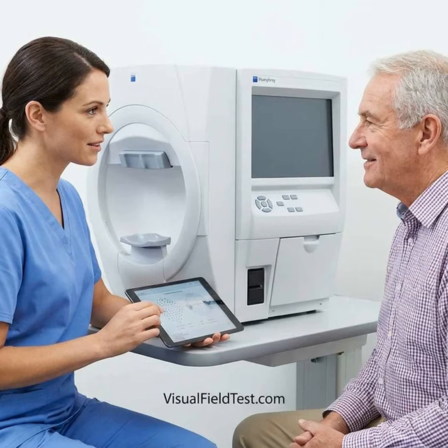Step 3. Demonstrate the correct response. Tell the patient, look steadily at the central target. Press only when a light is seen. Do not move the eyes toward the light. Blink normally. Do not try to predict when the next flash will appear. Ask for a pause if needed. The exact response instruction should match the instrument's protocol.